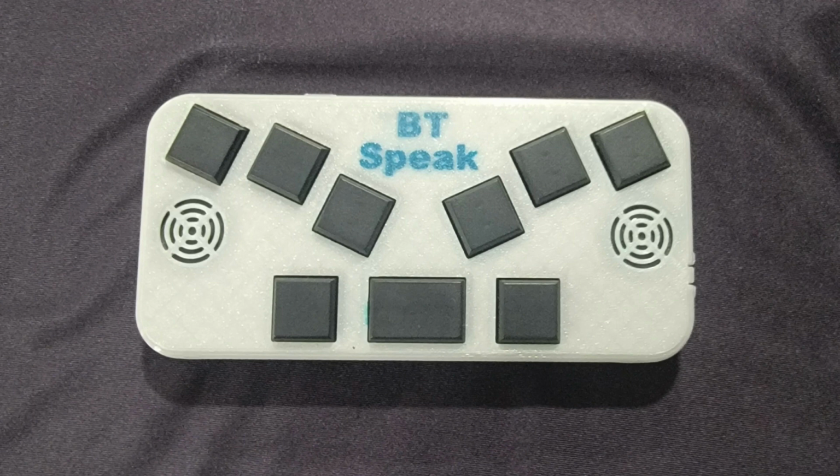Once you kind of get those keystrokes down, it really doesn't take a long time. So again, this can be really useful in sending text messages, in composing emails, maybe before you have your phone out or you just want to get some thoughts together and get that email already written. This enables us from the BT Speak Basic to go ahead and really put text wherever we want to. I'm just using this iPhone as an example.